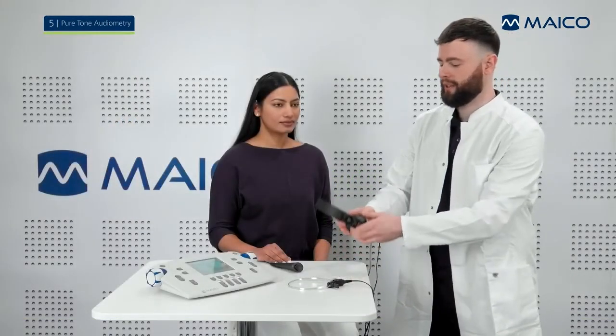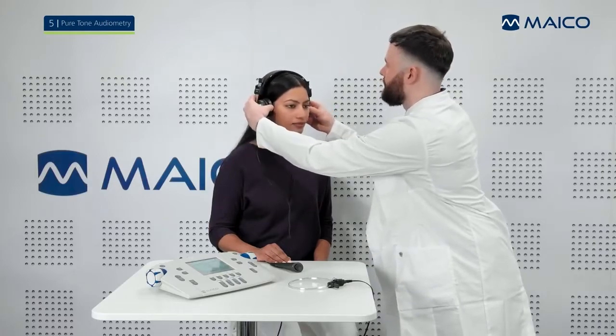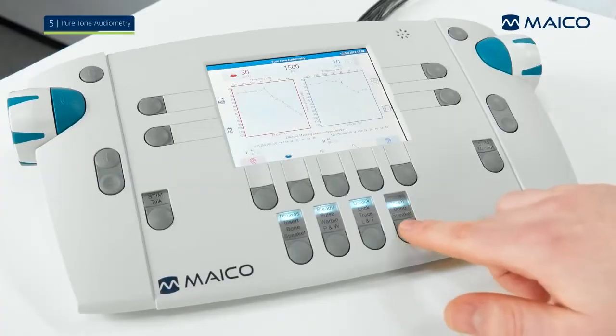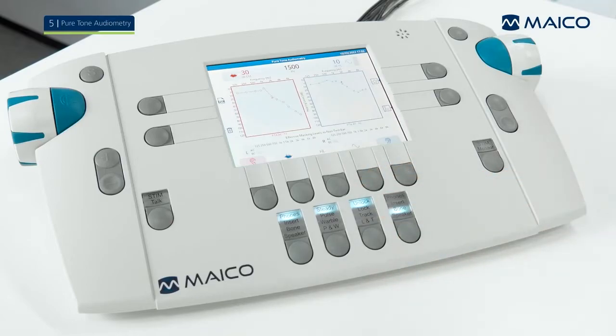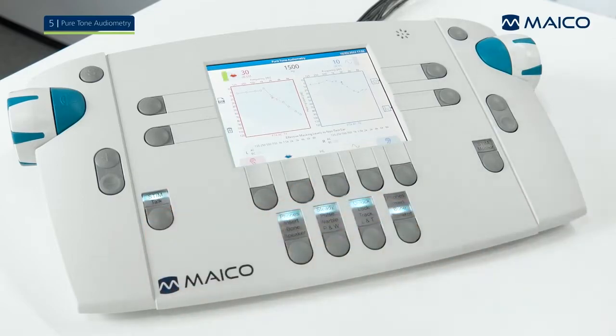Prepare the patient for the test by placing the corresponding transducer on the patient. Choose the corresponding transducer on the device. Then select either the ear for the channel or the test signal for the patient's ear to be tested, and, if necessary, the masking signal for the other ear.